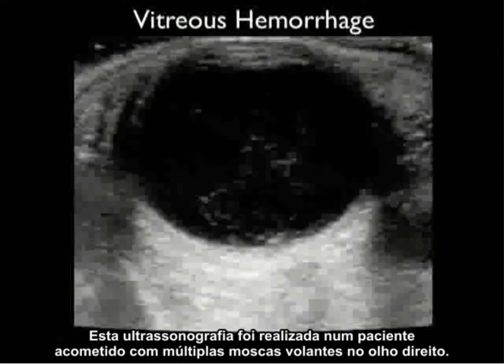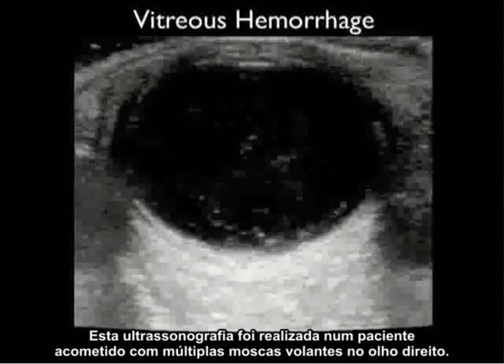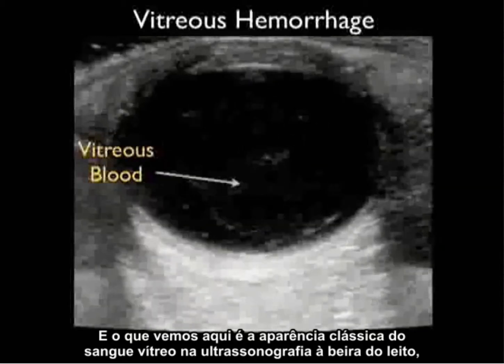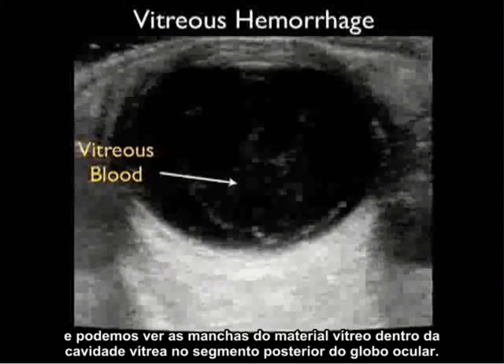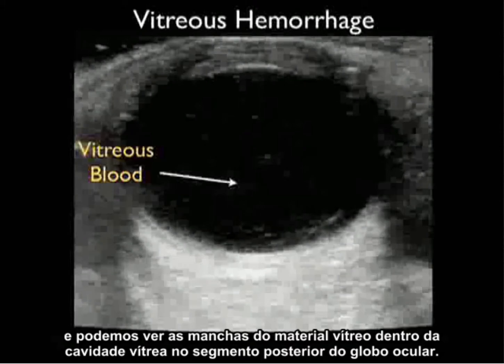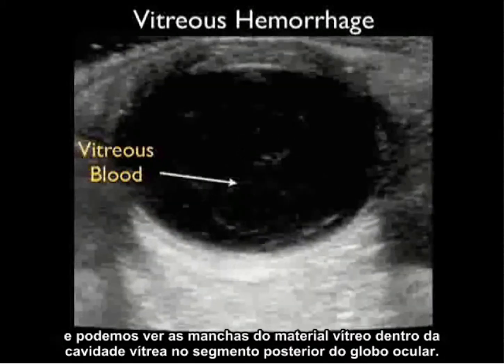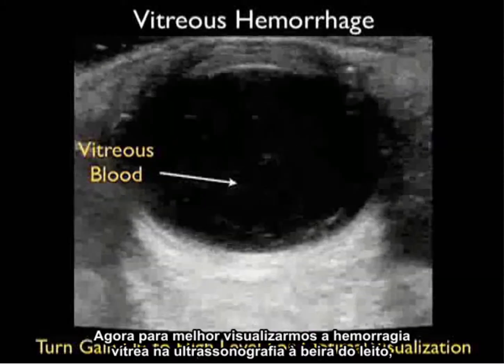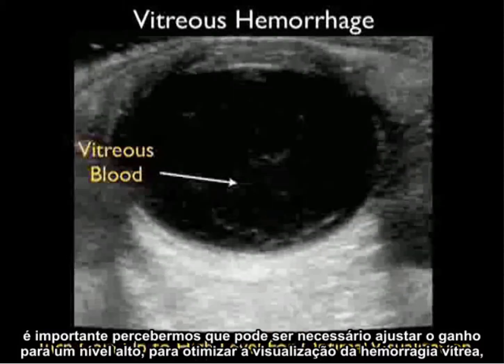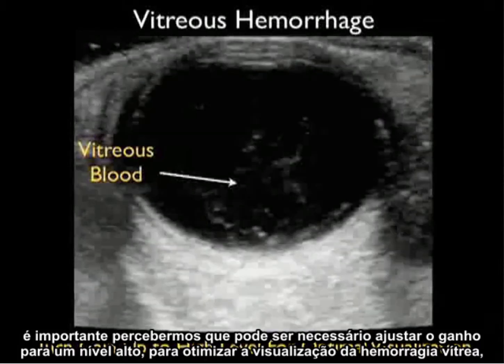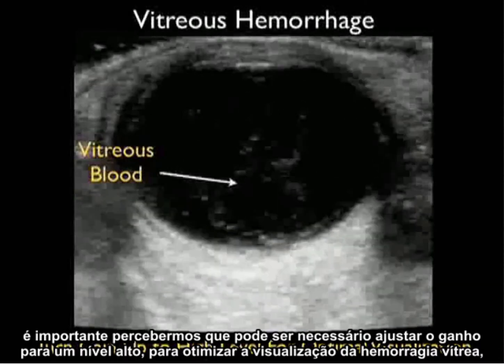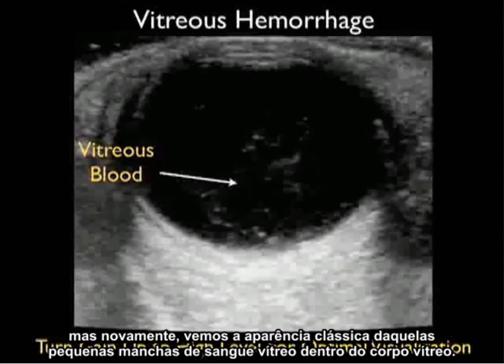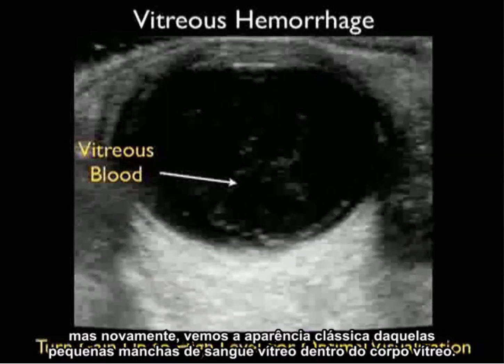This ultrasound was taken from a patient who experienced multiple floaters within their right eye, and what we see here is the classic appearance on bedside ultrasound of vitreous blood. We can see the speckles of vitreous material within the vitreous cavity, the posterior aspect of the eyeball. To best visualize vitreous hemorrhage on bedside ultrasound it's important to turn the gain up to a high level. Again we see the classic appearance — those little speckles of vitreous blood within the vitreous body.